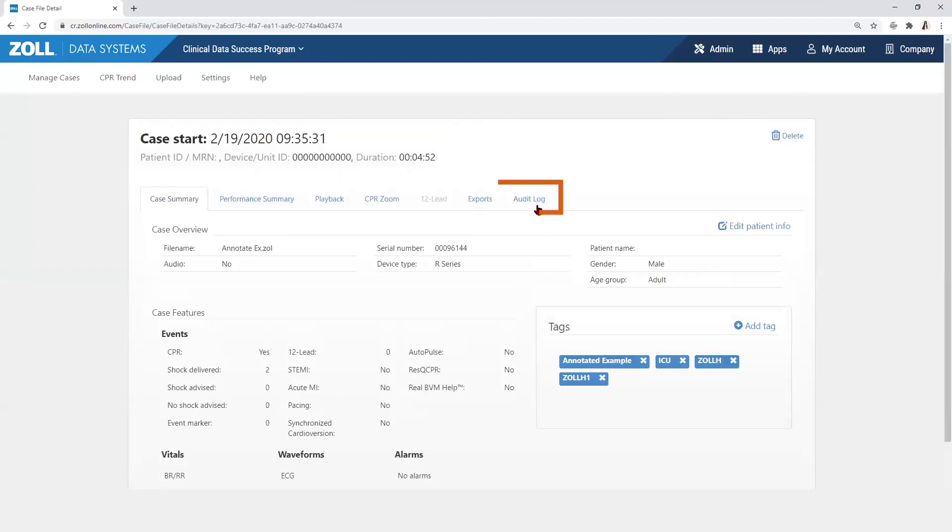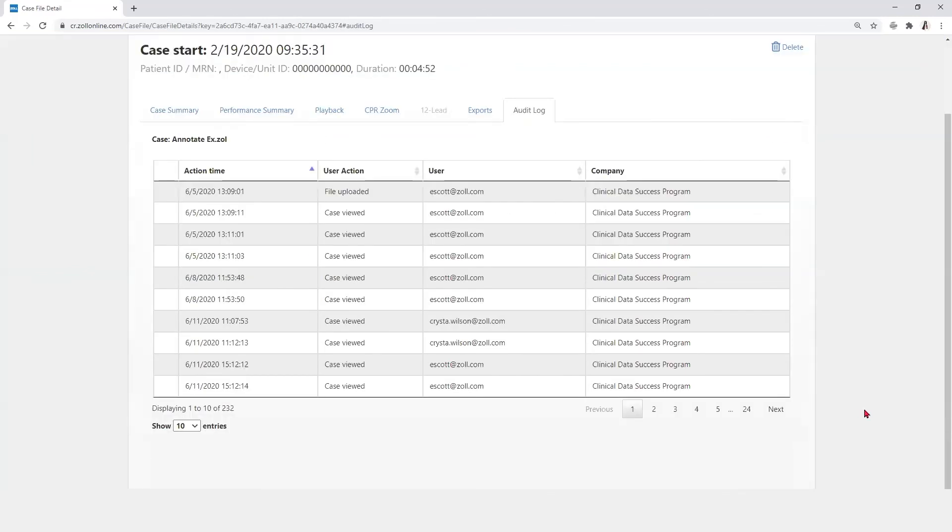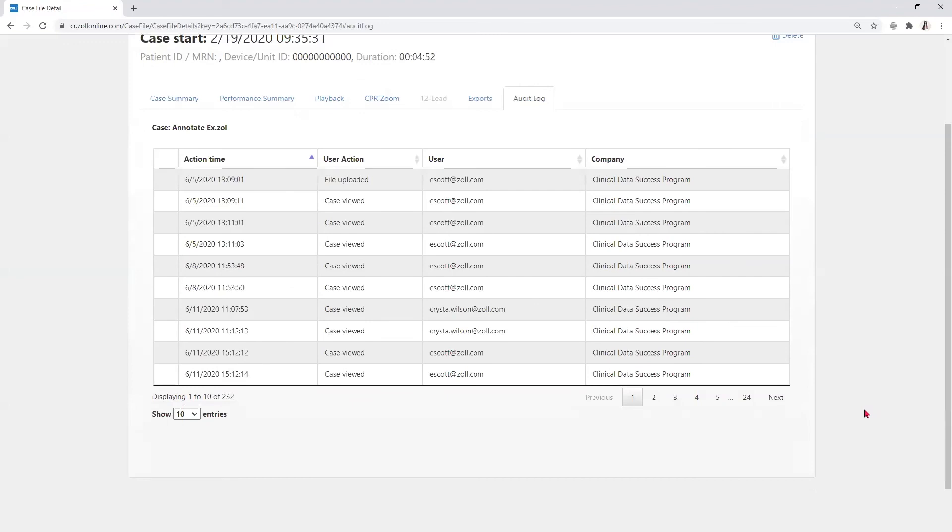Select the Audit Log tab to open the audit display. The audit log records all user actions on the case by date, time, action, name of the user, and the company, if applicable.